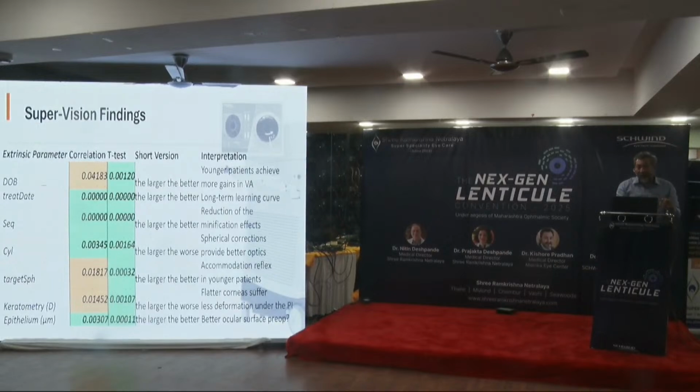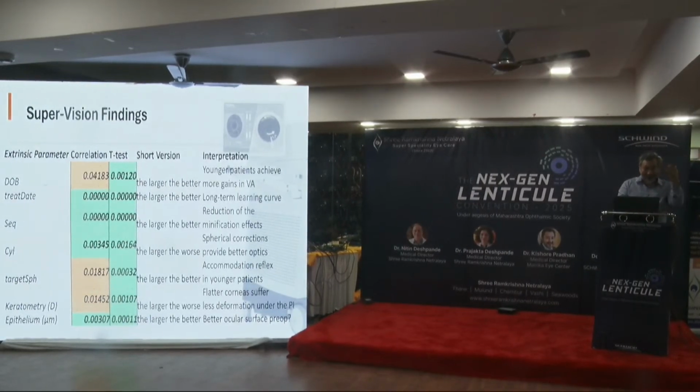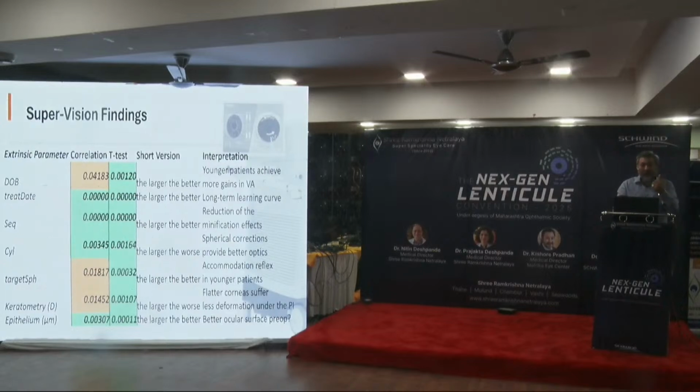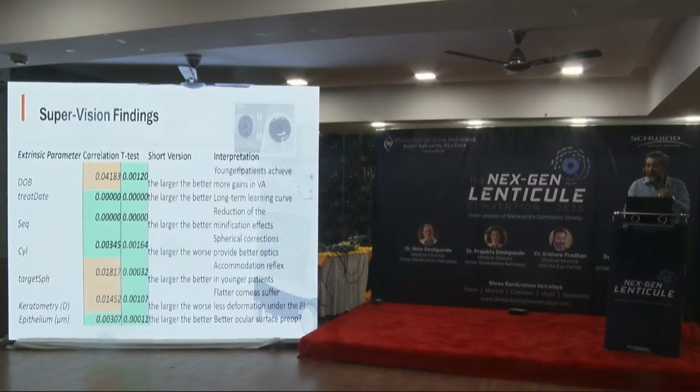On the extrinsic factor, you have to understand this is your side, okay? Not the laser side, your side. The date of birth. Younger patients do better because firstly they have more endothelial cells, the swelling goes off faster. Treatment date means how many patients have you treated?